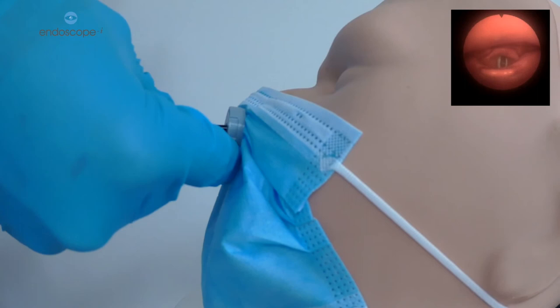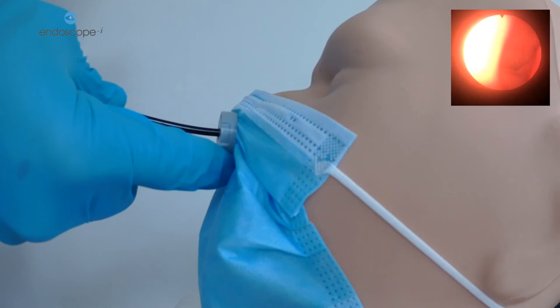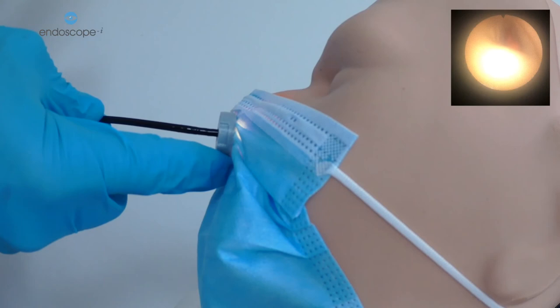Keep your finger on the bottom of the outer aspect of the valve for stabilization, just as you would do normally when performing nose endoscopy. Do this until you withdraw the scope and ensure that the scope is withdrawn safely from the patient. So let's get to it.